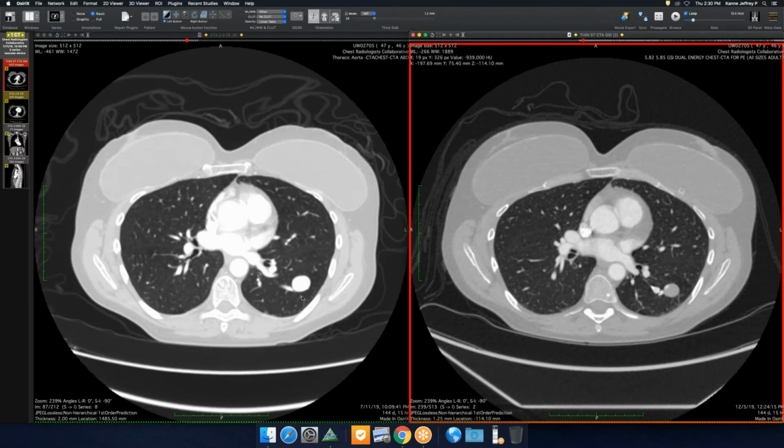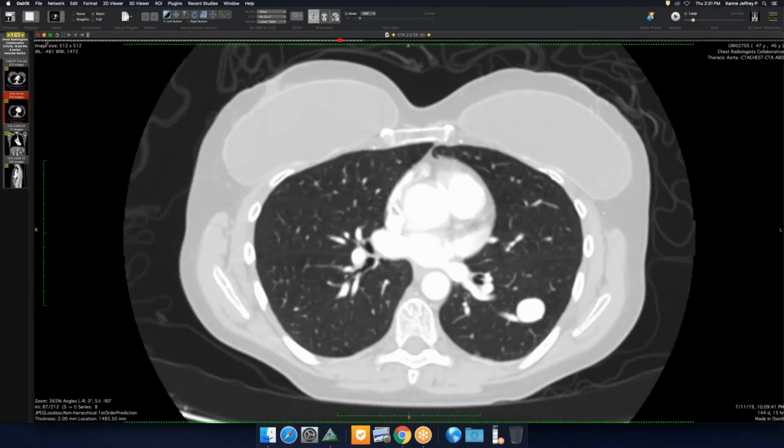So that's just interesting. It's an interesting treatment. It's a weird looking AVM, and it's a complication. I've seen them recanalize or have other channels, but I don't think I've seen one leak around a plug. So I thought that was kind of neat.